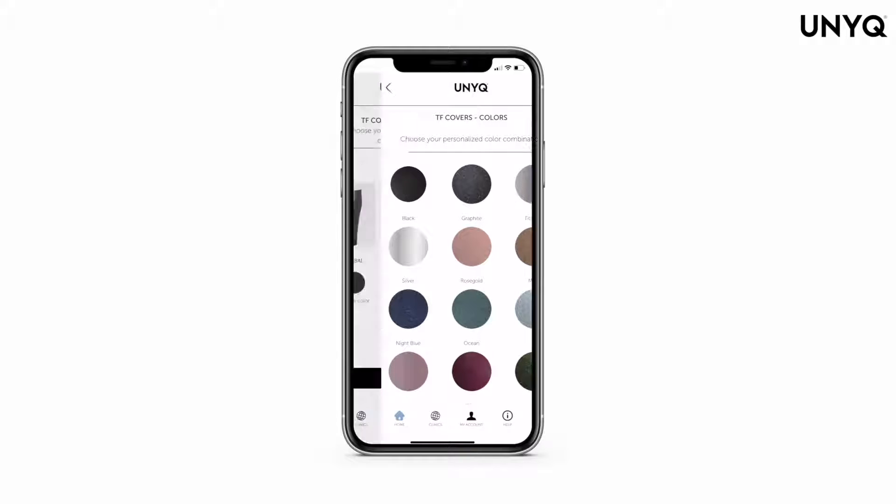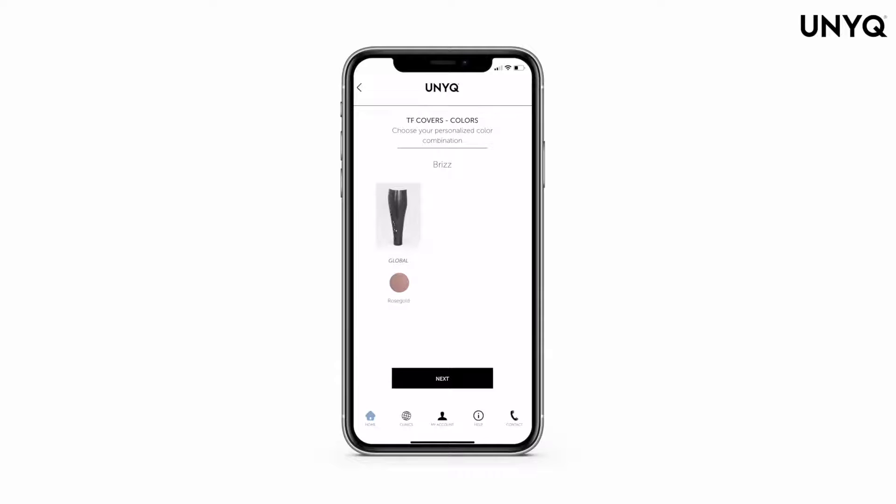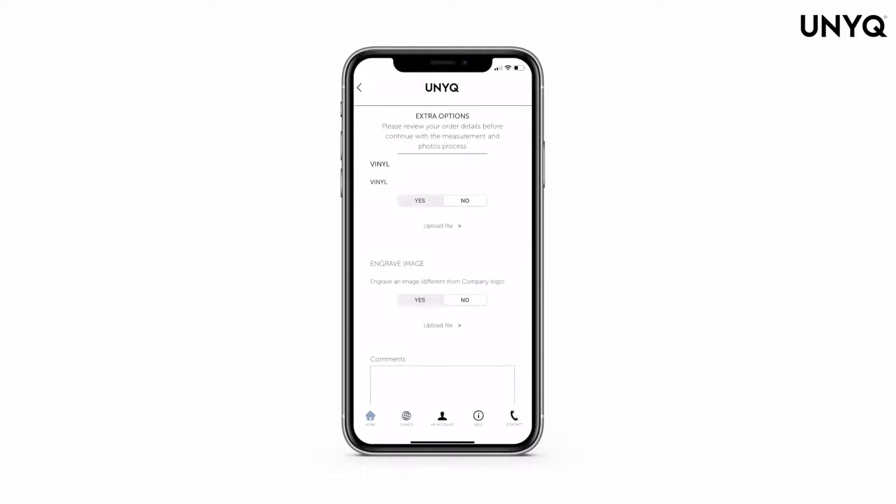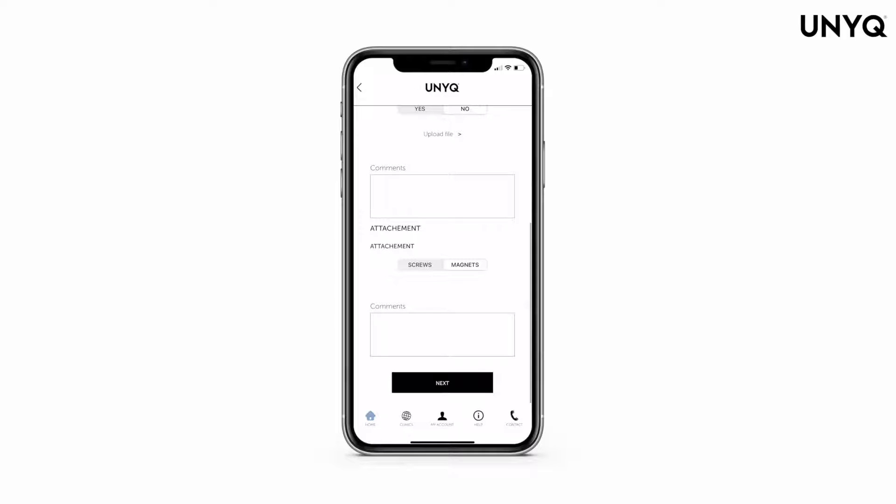Or the detail color — some covers are available in a single color only. Remember to choose the paint coating: matte or gloss. Select if you would like to have a vinyl and engraving added to your cover. Then in the attachment section, decide if you prefer screws or magnets as a closing mechanism.